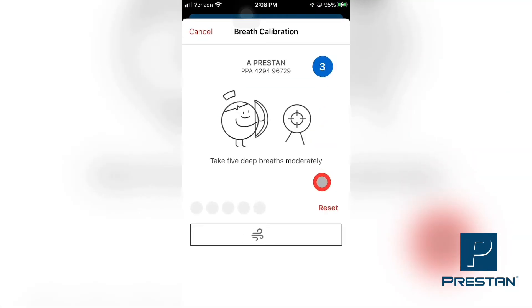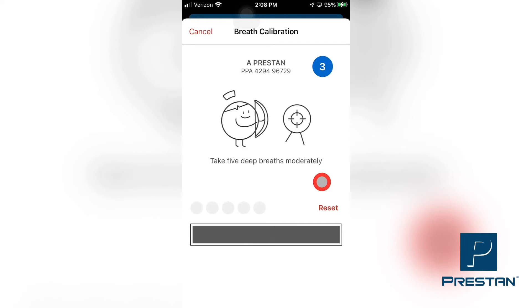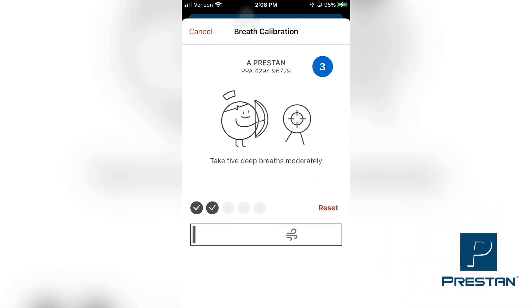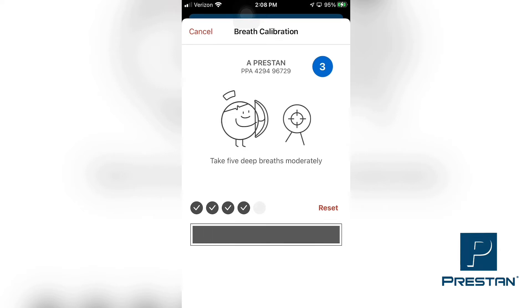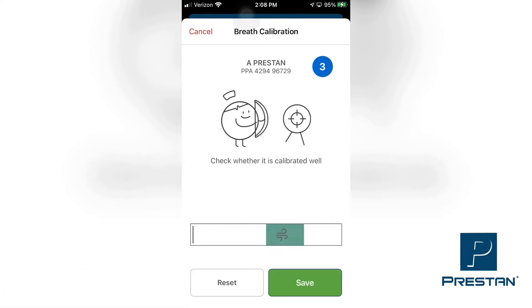Follow the directions on the screen to perform 5 deep breaths into the mannequin. Make sure that you are properly performing the head tilt procedure to open the airway of the mannequin, so that the airway is unobstructed during this procedure. Ensure that the lung bag is inflating and the chest rise is visible in the mannequin. Once 5 breaths are completed, the app page will automatically change and the app will ask you to verify that the sensor is calibrated properly.